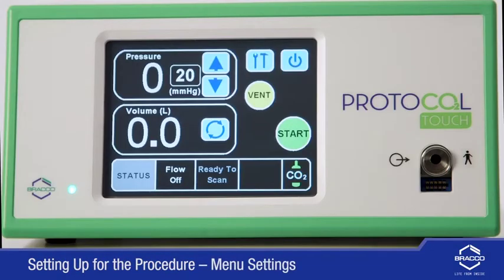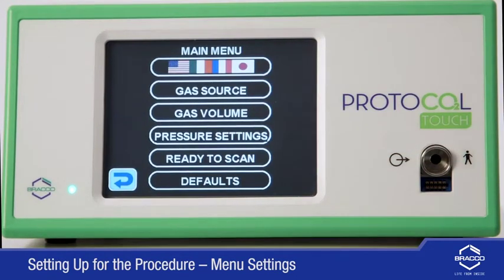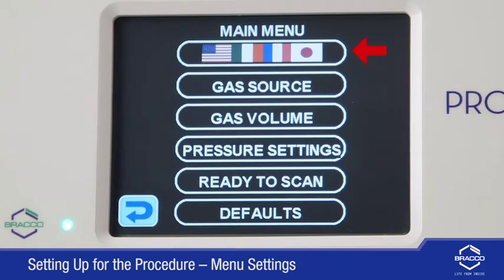Located at the top of the screen is an icon that looks like a toolkit. Press this icon to get to the main menu screen offering 6 selections: language, gas source, gas volume, pressure settings, ready to scan, and defaults. Select the choices that best suit the needs of each procedure or physician preference.